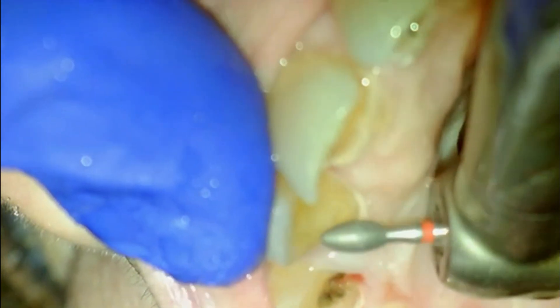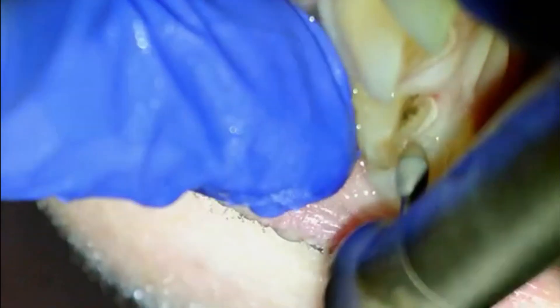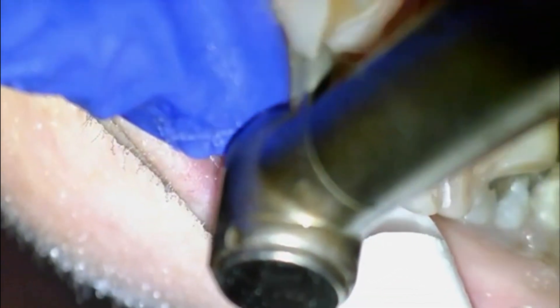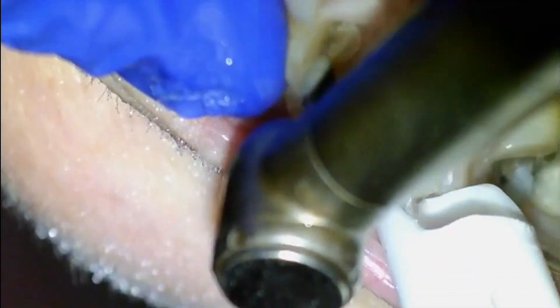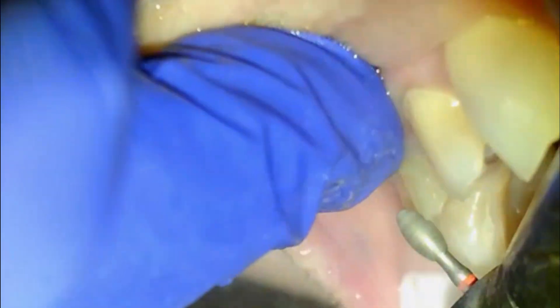We want to give the lab just enough to make these as perfect as possible. Every move you make, every piece of tooth structure you remove has a reason, and you constantly have to be thinking about your lab tech. Another reason we need to remove enough structure off the back of the teeth is that you always want a concave palatal aspect on your crowns. If you have a convex aspect, that's not natural — it's not going to allow the tongue or bottom teeth to properly sit when the patient is making S sounds, and it will give them a lisp or whistle. So you want enough space for the lab to make a concave crown that matches what a natural tooth would look like.